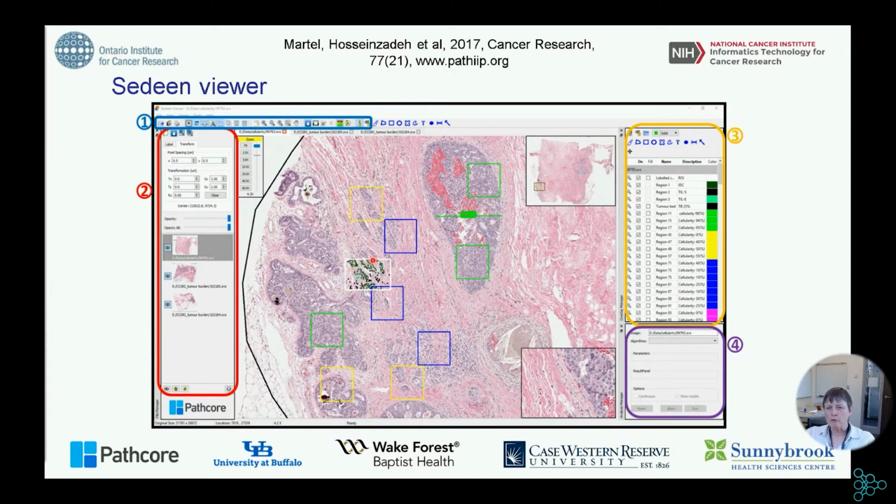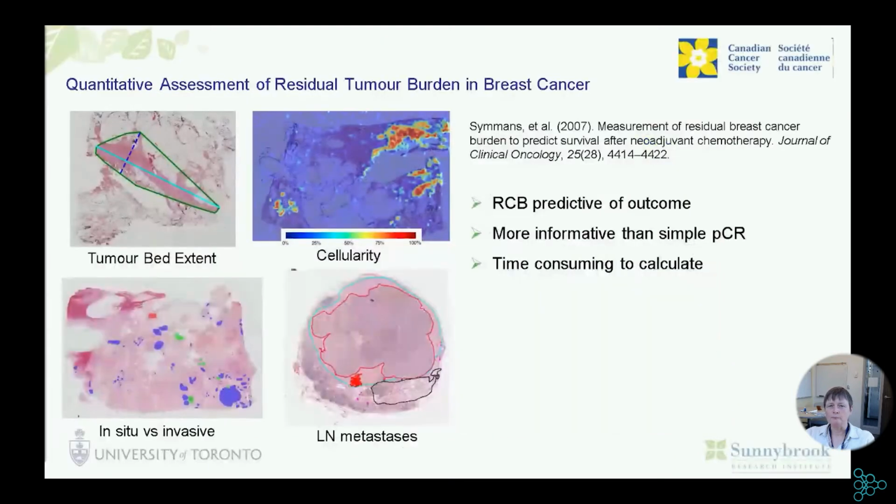You can't really give a pathologist a small box like this and ask them to give some kind of diagnosis, because they'll always want to pull out and see what the context is and then go back in and see it. So this is one area, again, where it's more complicated than regular imaging.